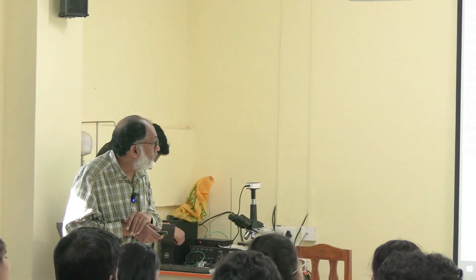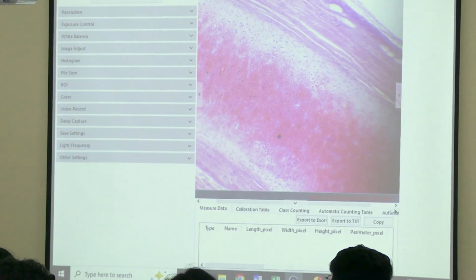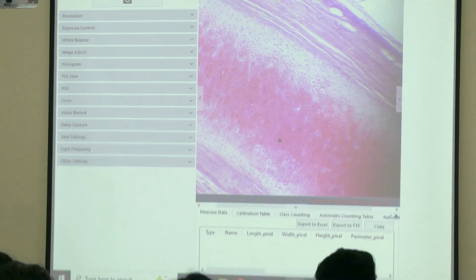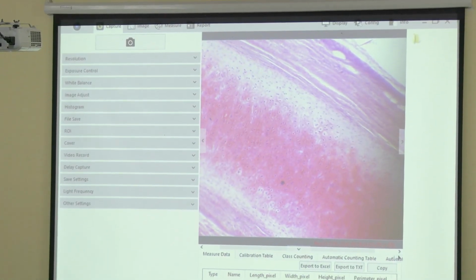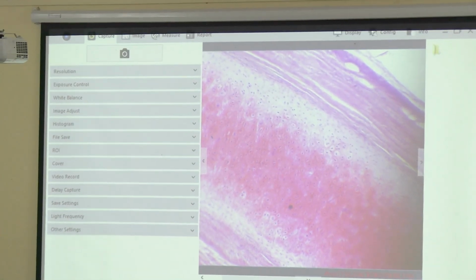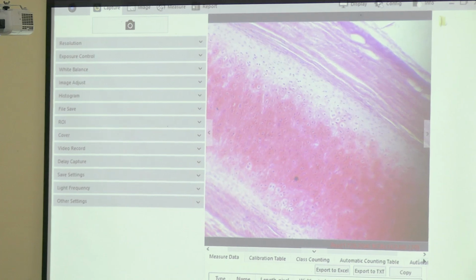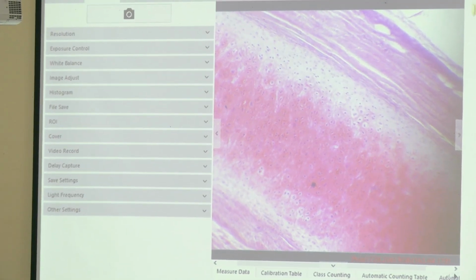And here also you see the cell nest. Here a cell nest contains a maximum group of 1 or 2. There you found in hyaline cartilage groups of 4. But here is there any group of 4? Any? You see?